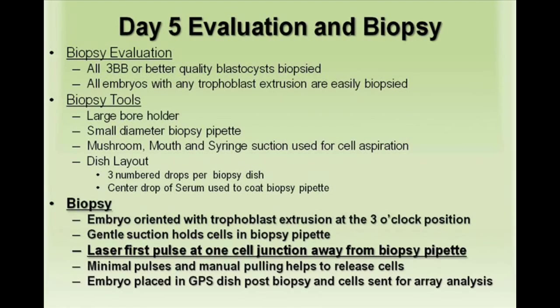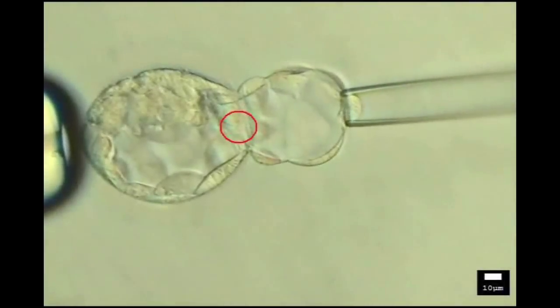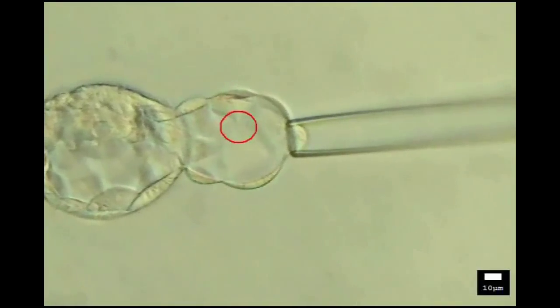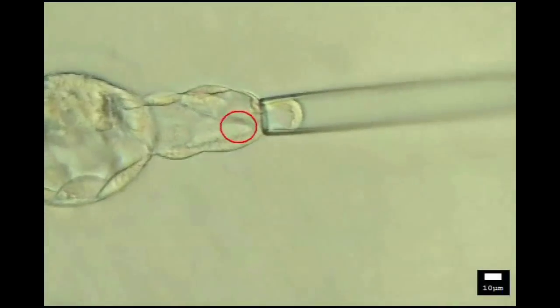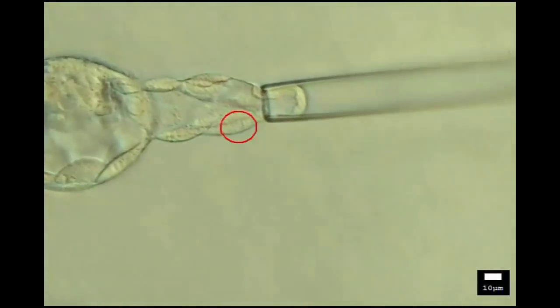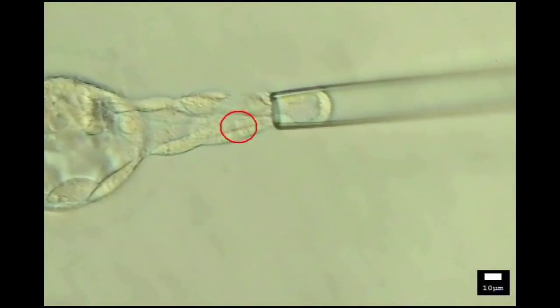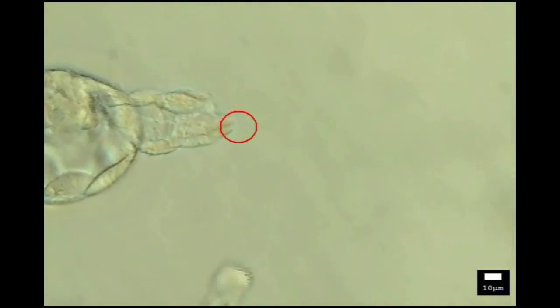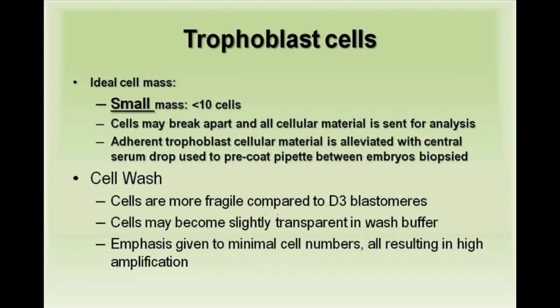Embryos are then placed in a GPS culture dish. Here is an example of our technique. The blastocyst is held with the trophoblast at the 3 o'clock position. The embryo is oriented around the laser objective with the first pulse at the first cell junction away from the biopsy pipette. Two more pulses and gentle suction result in a small mass of trophoblast cells, preferably less than 10 cells, with all cellular material sent for analysis.